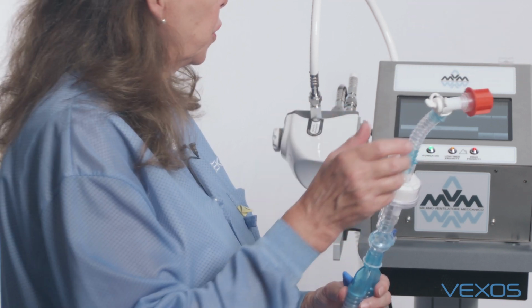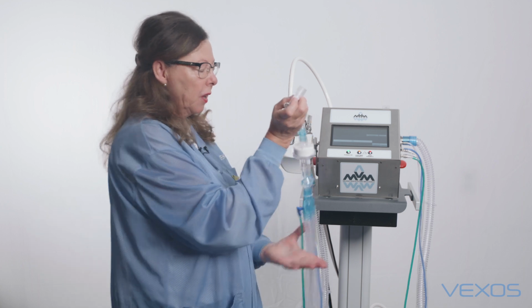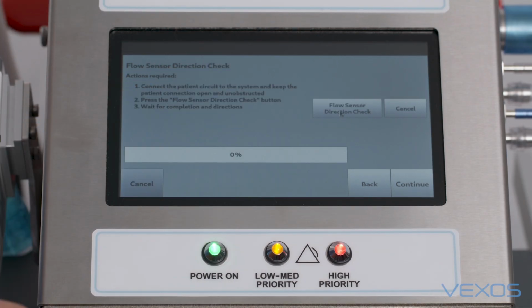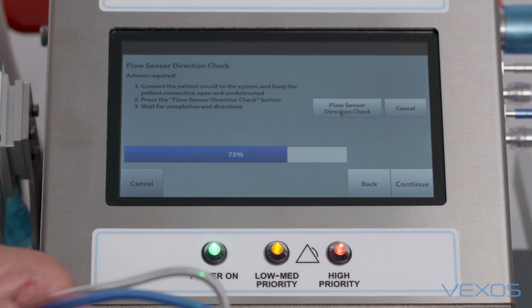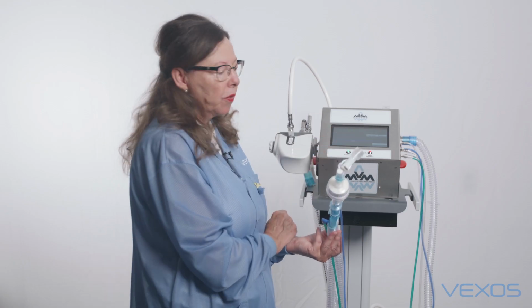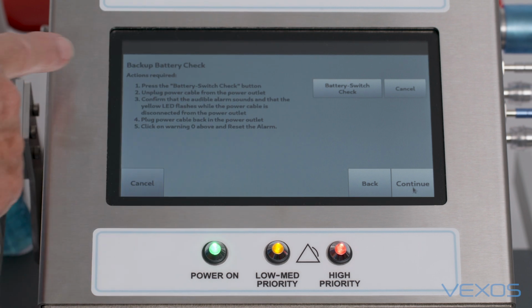Again, follow the directions. This time it says remove the cap, make sure the circuit is open, and just press flow sensor direction check. Again, it'll run through the check. After 100% of it's done and it's successful, it's finished. We now can press continue.